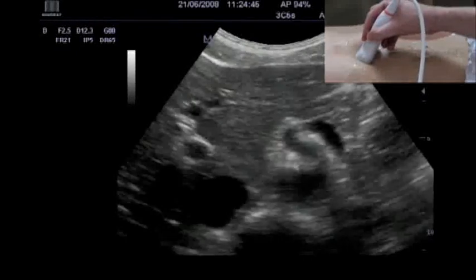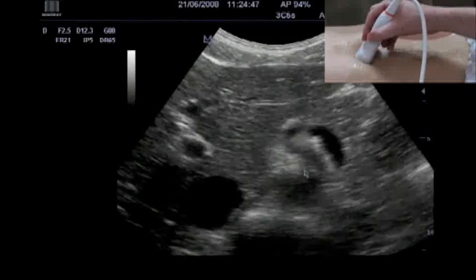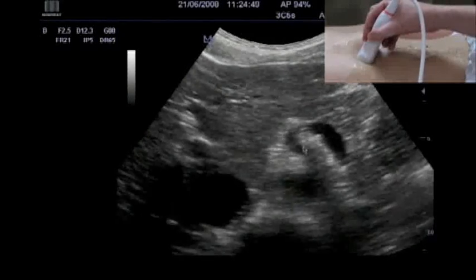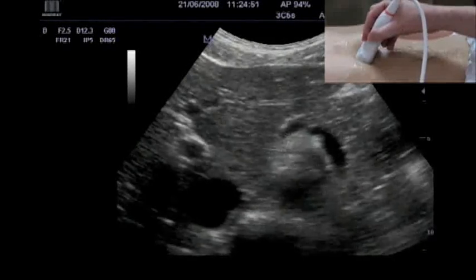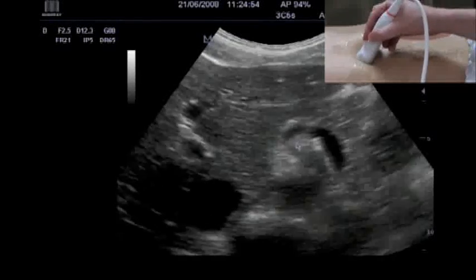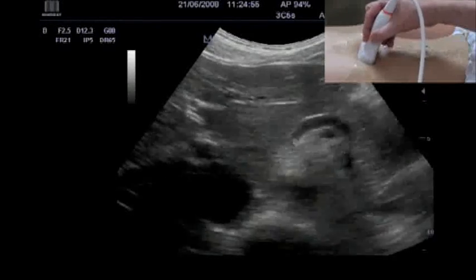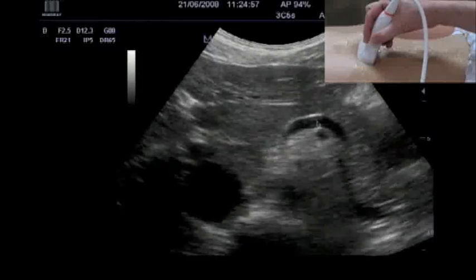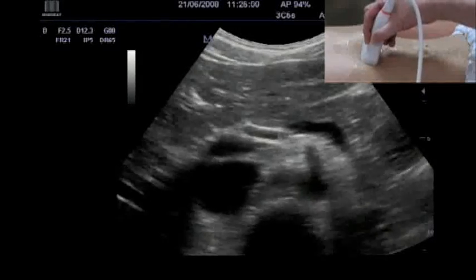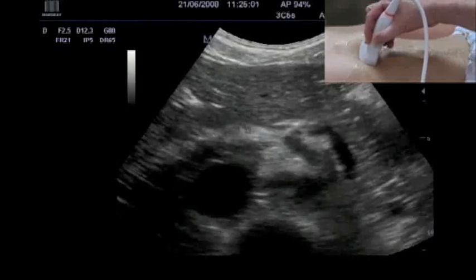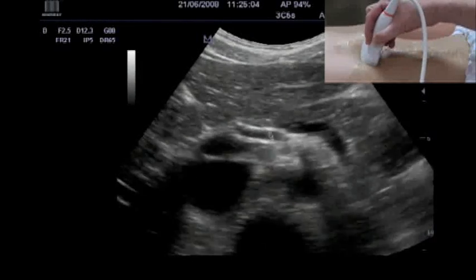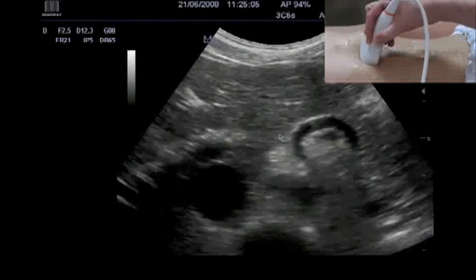We can see the different vessels that arise from the aorta. Here first is the celiac trunk, which gives rise to the splenic artery and the hepatic artery. Here you see this image.